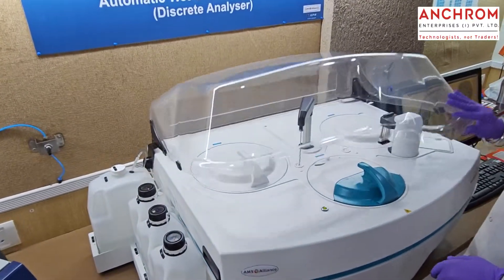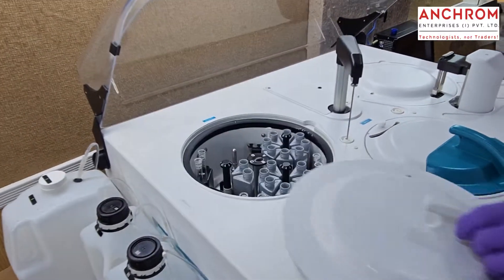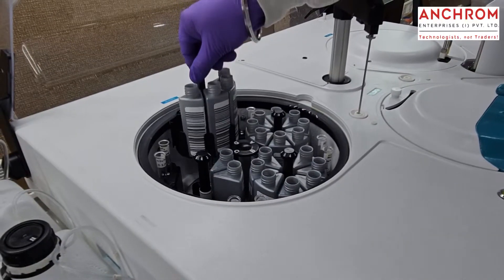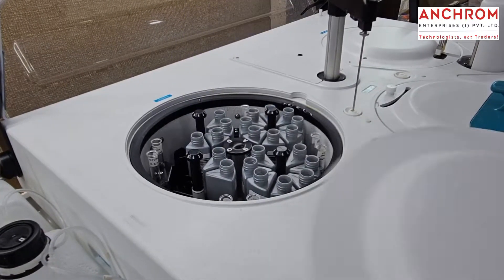Then you put your reagents in the refrigerated reagent bay, which can hold 72 reagents. Also, you save a lot of money by cutting 90% of your reagent use.